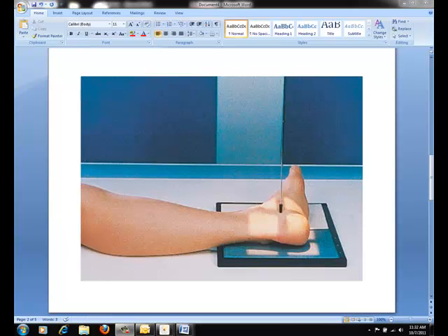Now we are ready to shoot a lateral projection of the calcaneus. We are going to shoot the medial lateral. Have the patient lay supine and turn toward their affected side until the leg is approximately lateral. You may need to support underneath the knee to get the patient's calcaneus in a true lateral position. Adjust the calcaneus to center in the middle of the IR.